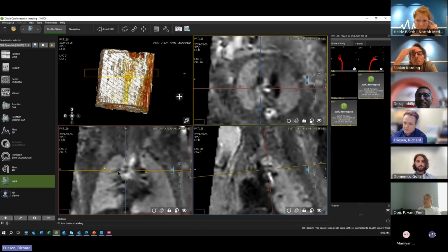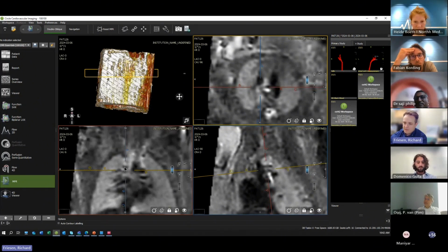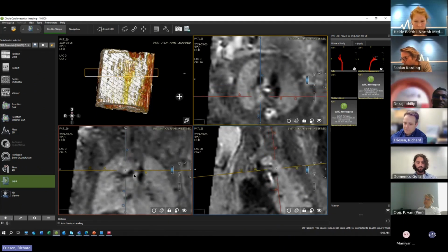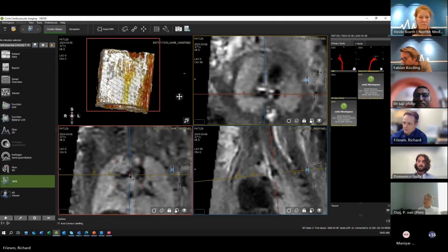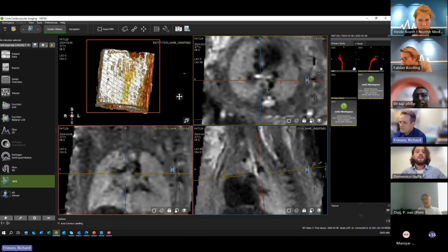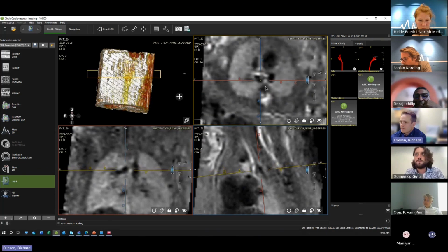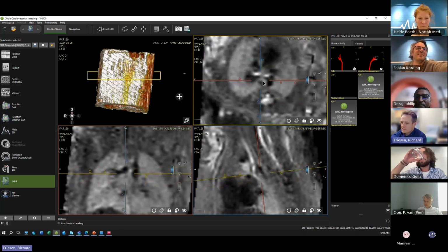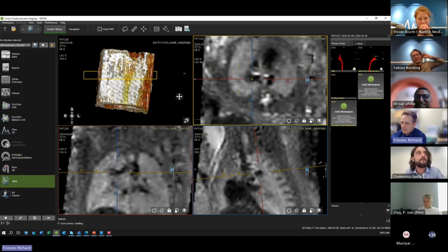So this one appears to come more laterally into the SVC, and another one comes a little bit more posteriorly, which again may represent an azygous vein, but where we follow that vein down posteriorly, it comes into this confluence that appears to be coming down, that we follow in from those pulmonary veins, with a dilated vessel coursing superiorly and laterally.